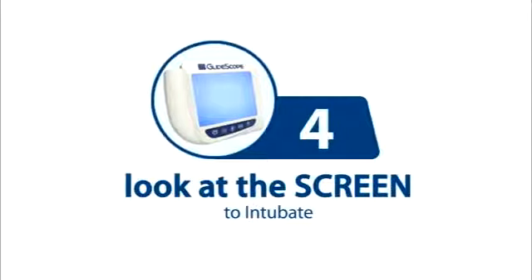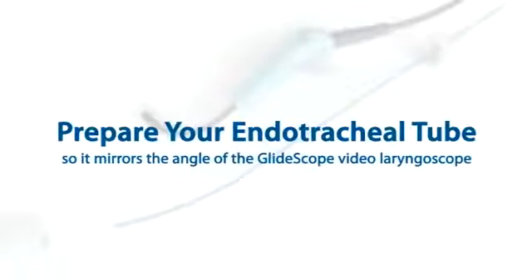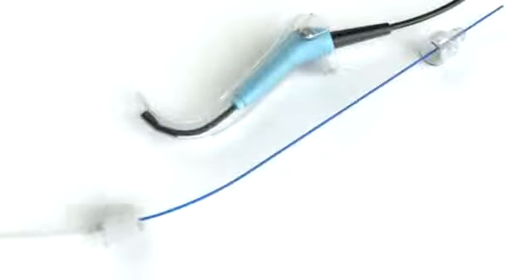It is advisable to use a stylet with the GlideScope video laryngoscope to ensure successful pediatric intubation. Begin by preparing the endotracheal tube, which in this case is shaped by a malleable stylet to complement the unique blade angulation of the GlideScope video laryngoscope. The correctly angled endotracheal tube will have a hockey stick appearance to it.